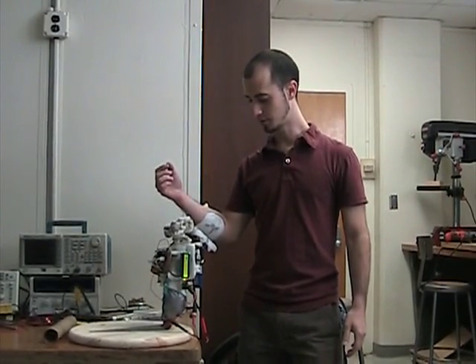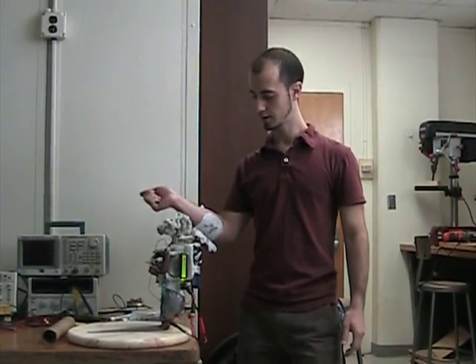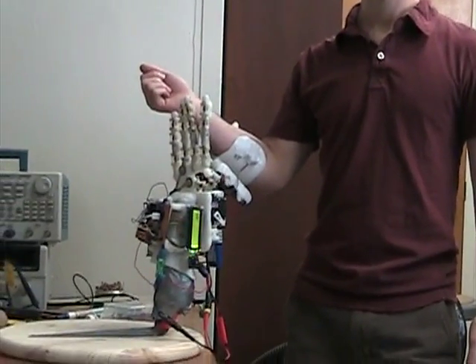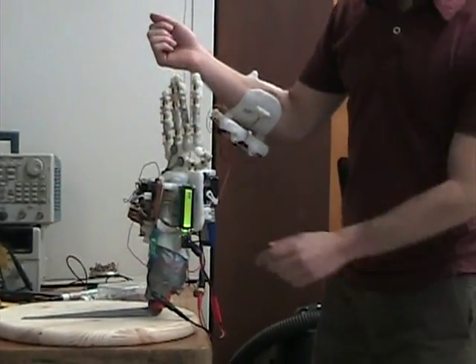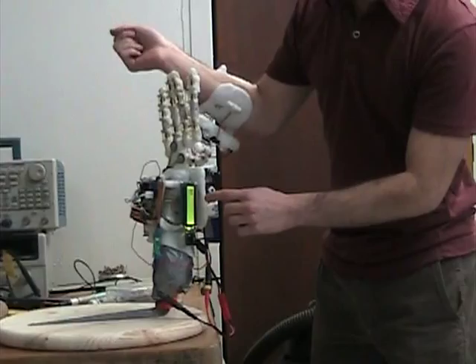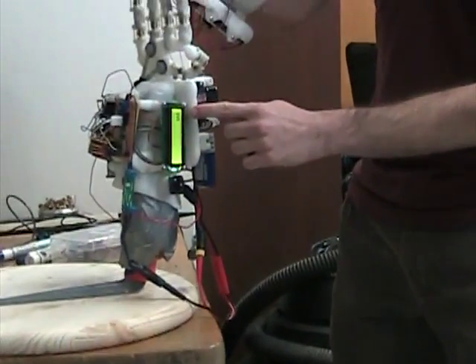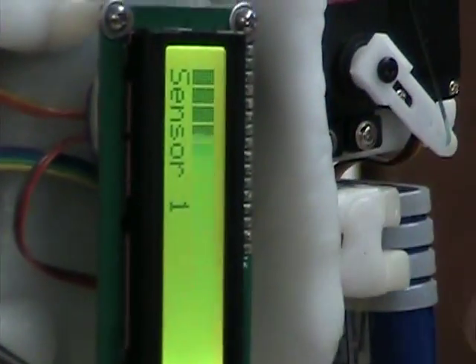It can perform several functions. It can open and close — when I open, it will extend and extend the hand. It plots sensor information on the screen, so when I extend the hand you can see how it moves a bar. It has buttons so I can change the screen and display different sensors.